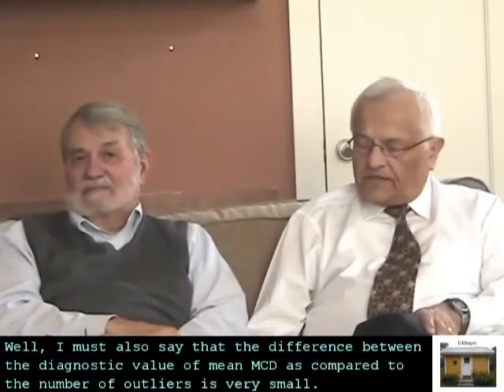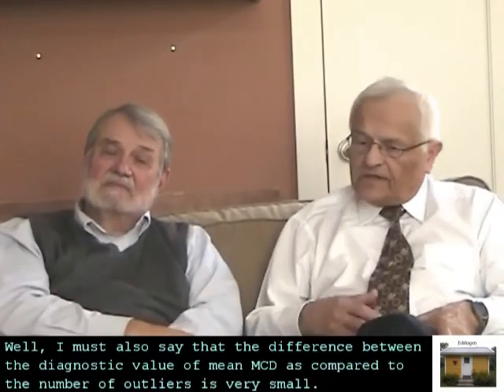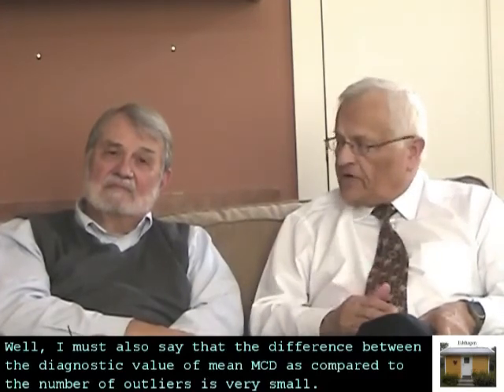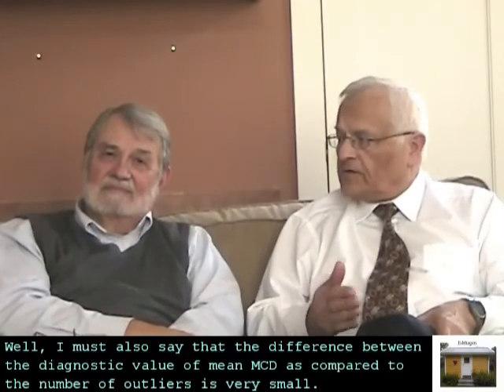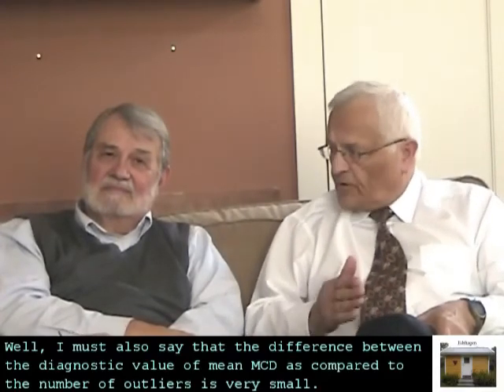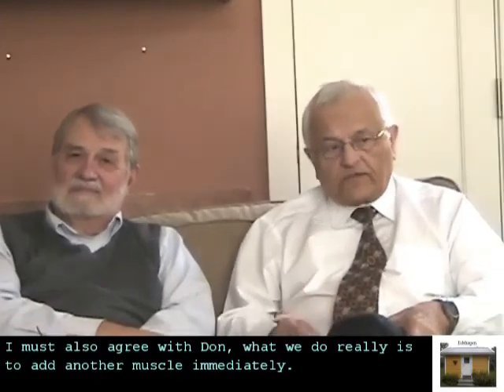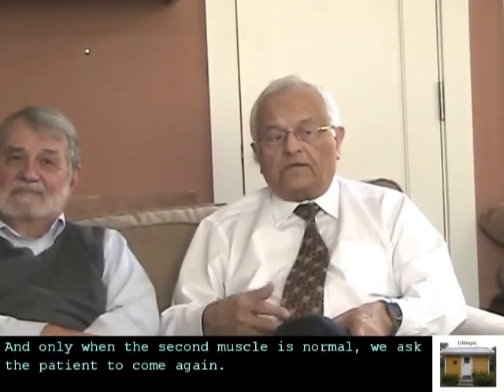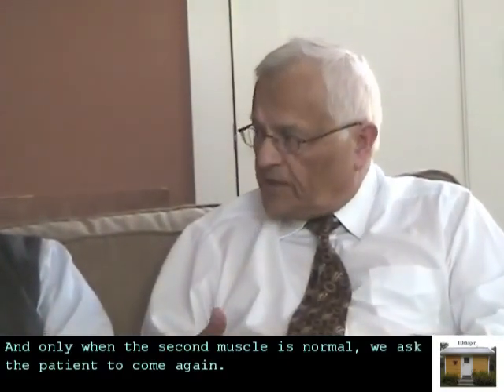Well, I must also say that the difference between the diagnostic value of mean MCD as compared to the number of outliers is very small. And I must also agree with Don, what we do is really to add another muscle immediately. And even only when this second muscle is normal, we ask the patient to come again.